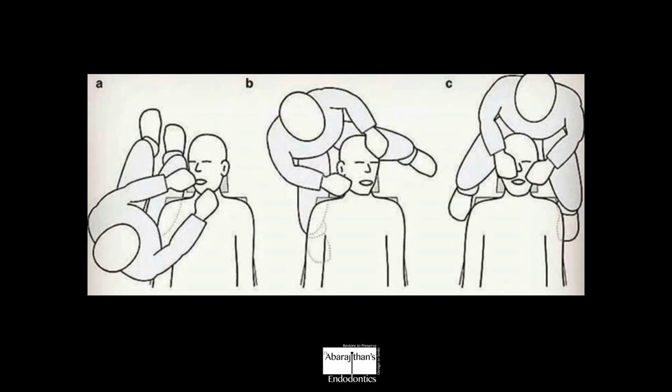When we learned dentistry in our undergraduate school, we were taught all these different clock positions for doing treatment on patients. So we must be knowing that. Even in my basic ergonomics video, I mentioned that for mandibular teeth, especially mandibular posteriors, we sit almost in a 9 o'clock position. When it comes to maxillary teeth, we come to a 10 and 11 o'clock position.